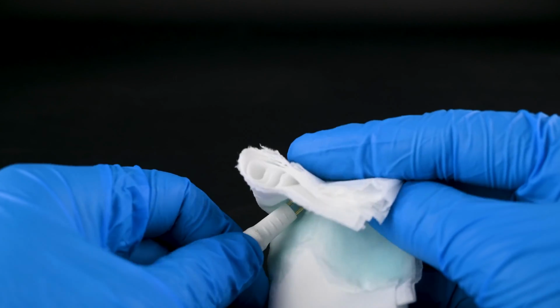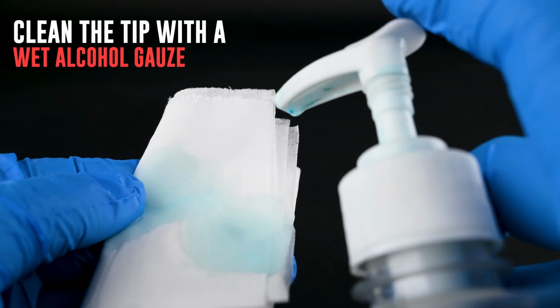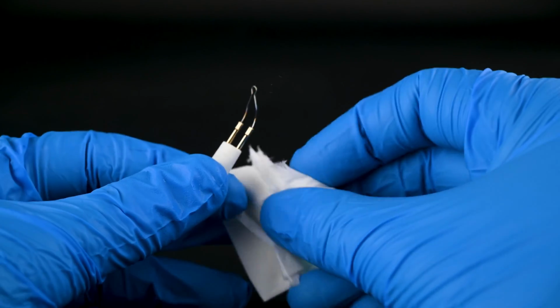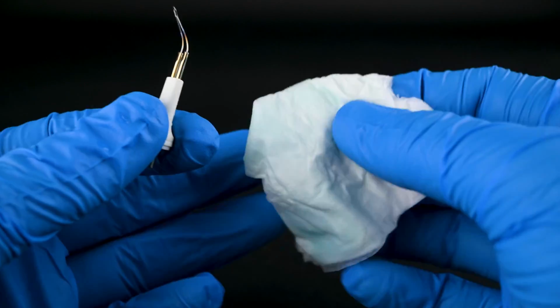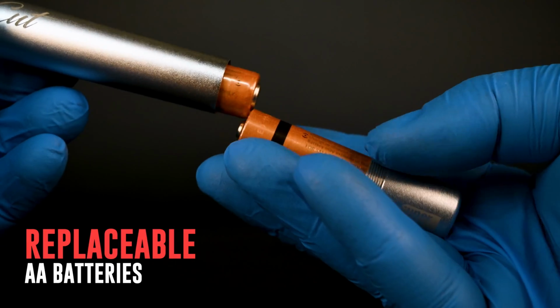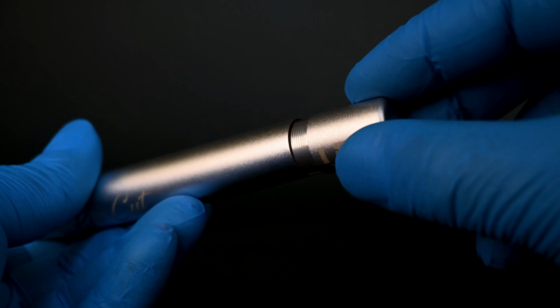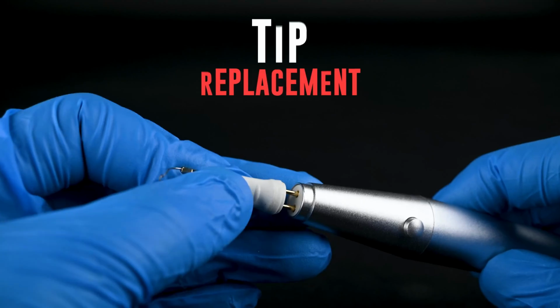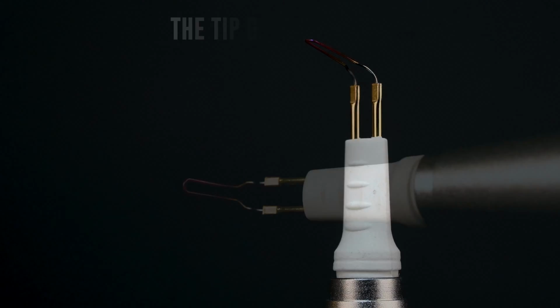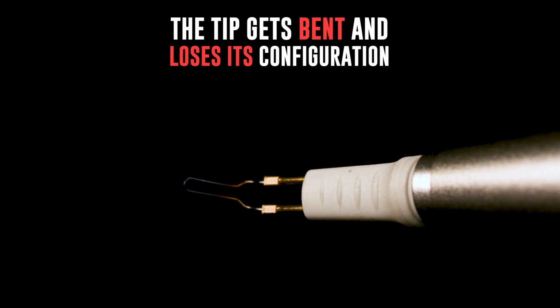Cleaning and maintenance. Tip cleaning. After using the Gutta Percha cutter, clean the tip with a wet alcohol gauze or sterilize it for the next use. This helps remove any residual Gutta Percha material from the tip. Battery replacement. The Gutta Percha cutter operates on replaceable AA batteries. Ensure to replace the batteries when necessary. Tip replacement. Over time, the tip of the Gutta Percha cutter may become worn or damaged. The tip gets bent and loses its configuration.